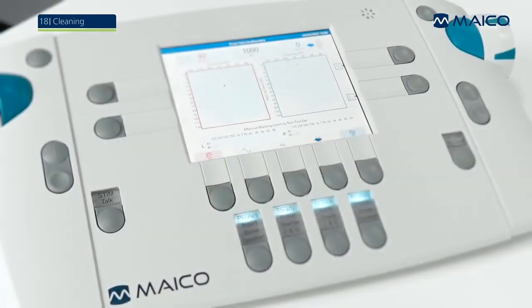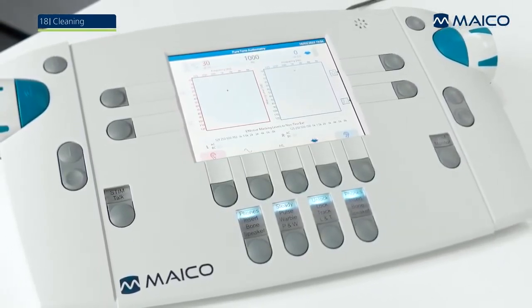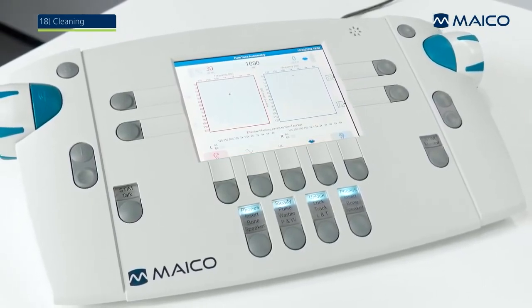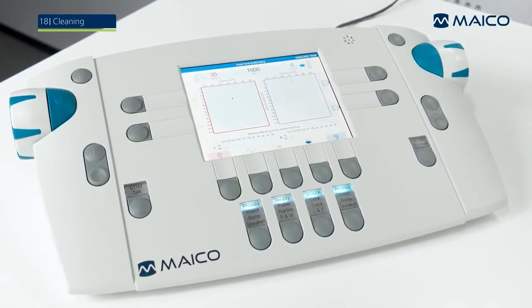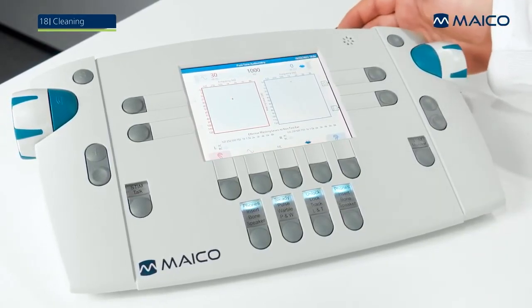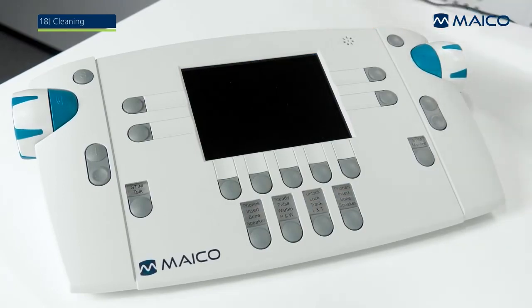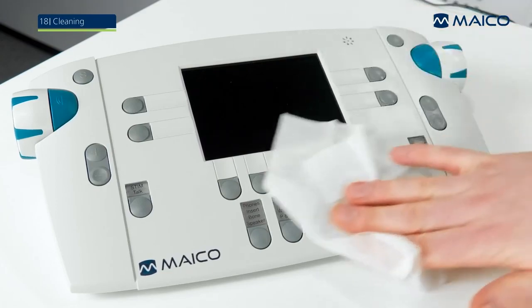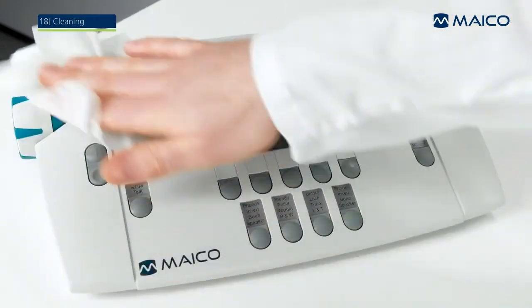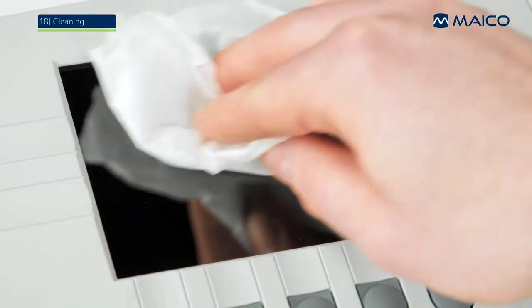It is recommended that the MA42 and the accessories, which come in direct contact with the patient, be subjected to a standard cleaning and disinfecting procedure between patients. Before cleaning, always switch off and disconnect the device from the power supply. For cleaning, use a lightly dampened cloth with soap water solution. Disinfect the device and accessories by wiping the surfaces with wet disinfection wipes and allow them to take effect for the duration recommended.